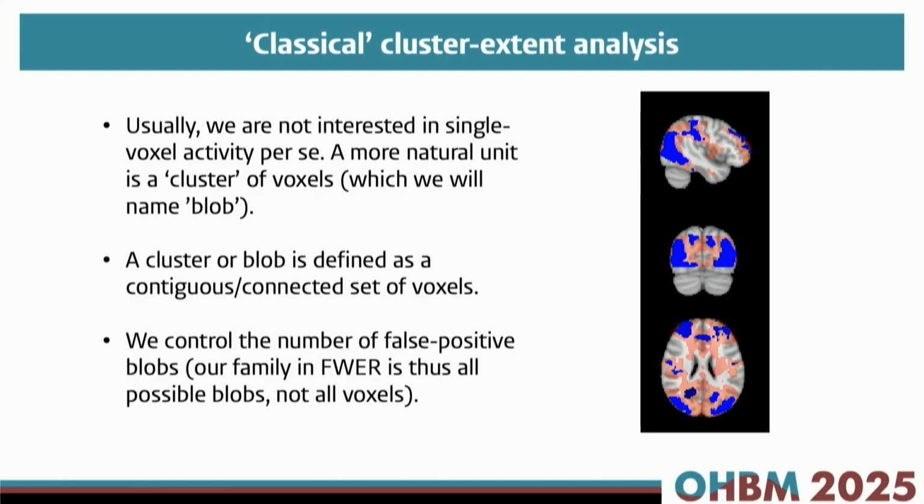So if we do what is called a cluster extent analysis, we control the number of blobs that we find with our alpha level. So we know that the blobs that we find are not false positives.